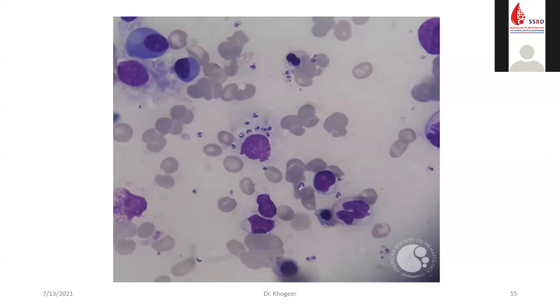No. So this is abnormal invasion, and it's distributed also extracellularly in addition to intracellularly. So this is Leishmania inside and outside of the macrophage, characterized by the kinetoplast and characteristic double dot appearance. So Leishmania is usually distributed intracellularly and extracellularly.